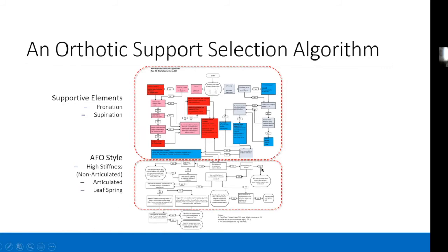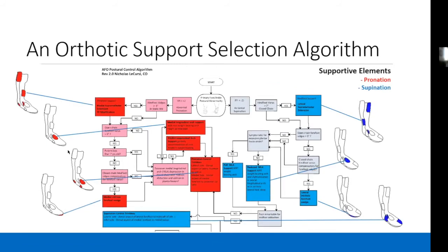And again, this is a topic for the 25th, not for today. And then this last section has to do with ankle axis alignment. And I am going to talk about that today in conjunction with this, because I think these two things can go together in posture management.